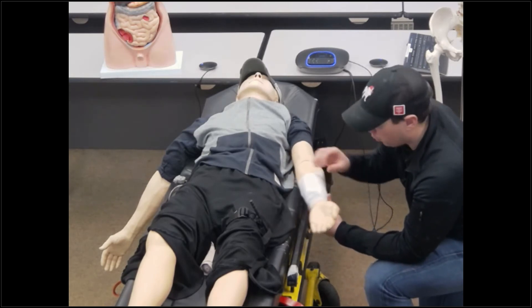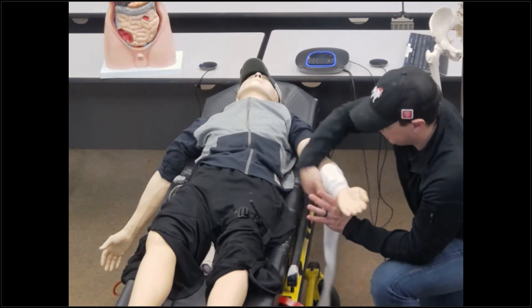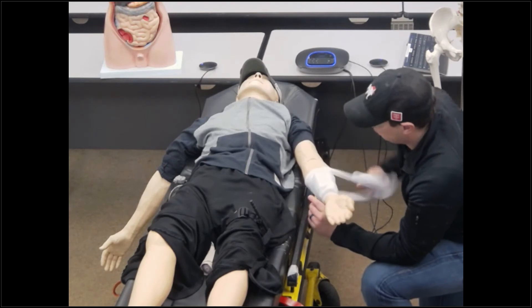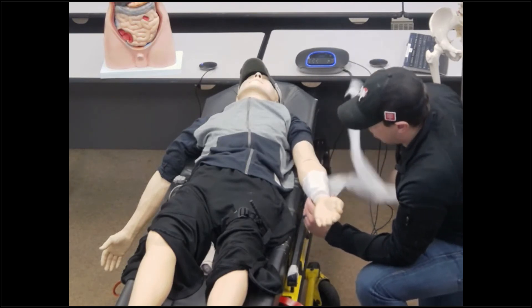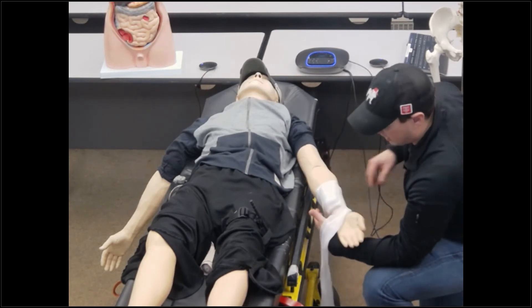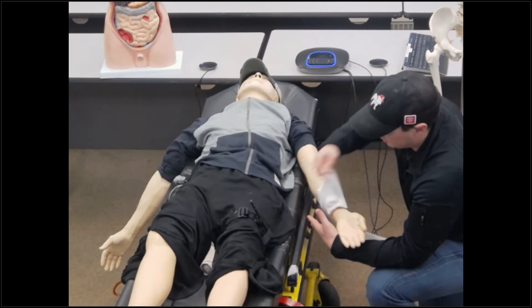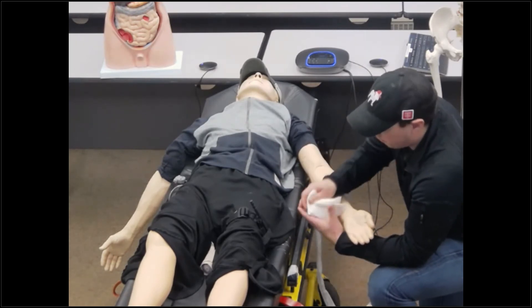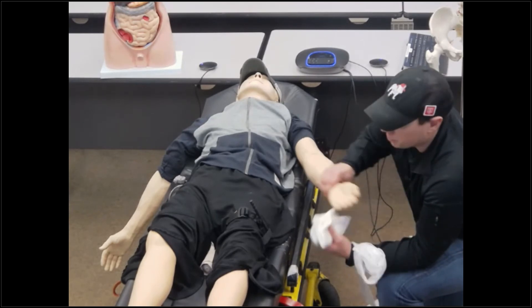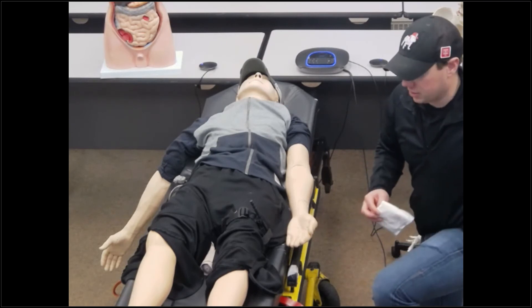You've got that deeper, shorter laceration handled. Now let's say our patient again tore their arm on a fence, and it's a very deep, long laceration. I'm going to do the same things — take BSI, ensure my scene is safe, go through my patient assessment — and eventually identify that this is an isolated injury with a substantial bleed, but not so severe that I immediately need tourniquet application.